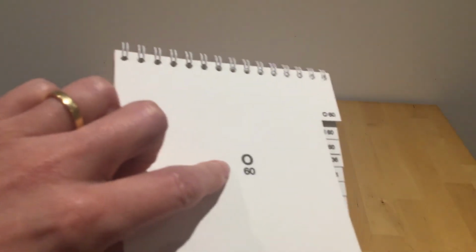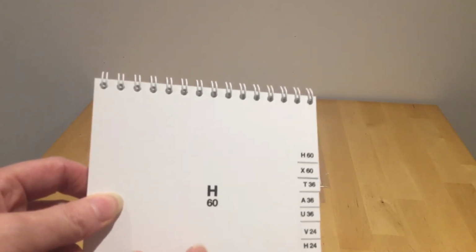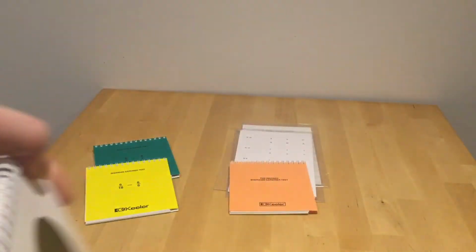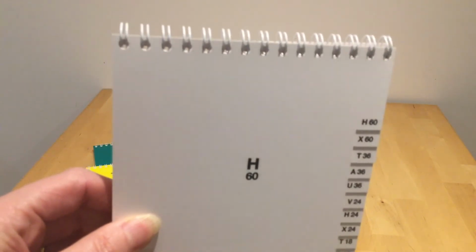Now it's not this one here, it's the one on the opposite side. So as you are the tester, this bit will be facing you, and the letter will be facing the child or young person. But you know if they give you the correct answer, you don't need to stick your head over the top.